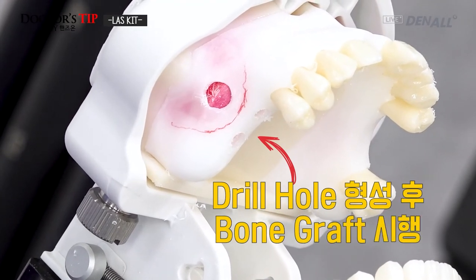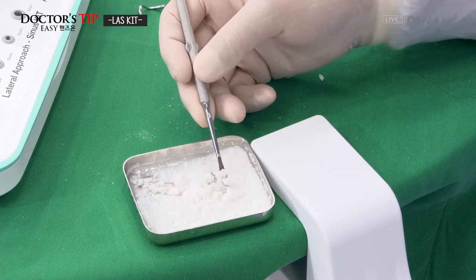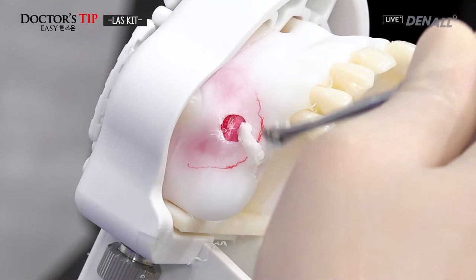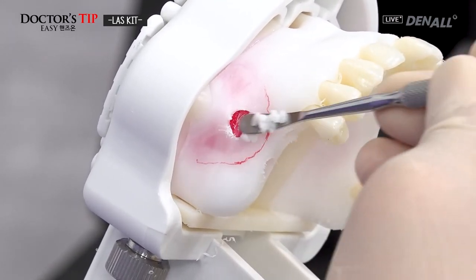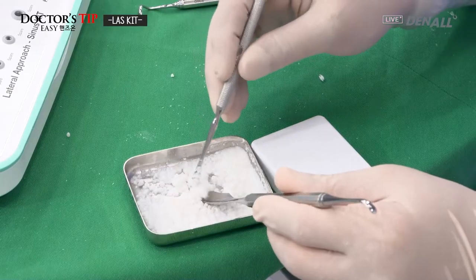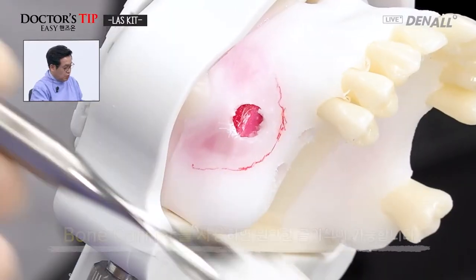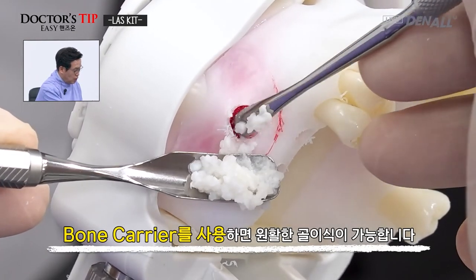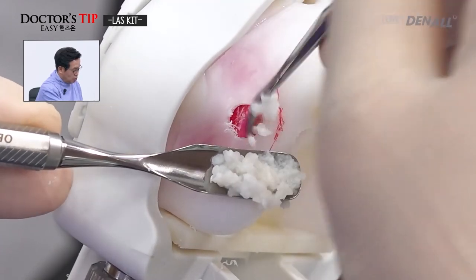So now I'll go for bone grafting. As you can see, with the free elevator, I put the graft material in here. And if needed, then like this, in the bone carrier, the graft material is put in so that the bone grafting can be done more smoothly on the sinus.